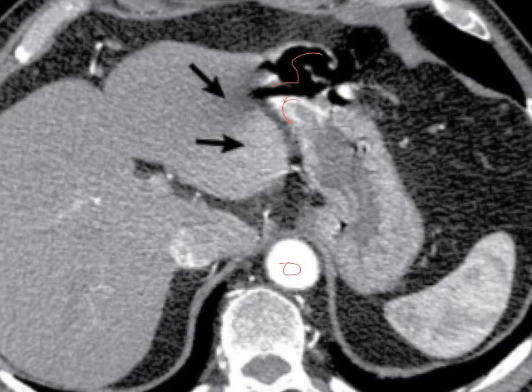But as the beam went from air to contrast to liver, that confused it. It was like, okay, I don't know what I'm seeing. Is the fart in the liver now? Right? Or is the barium in the liver? It created a gradient. The gradient's just a fancy word for, I don't know if any of y'all have daughters, but like those Trapper Keeper type folders where there's a unicorn on it or something, and there's a rainbow of different things, like a rainbow of red. I had those when I was a kid.